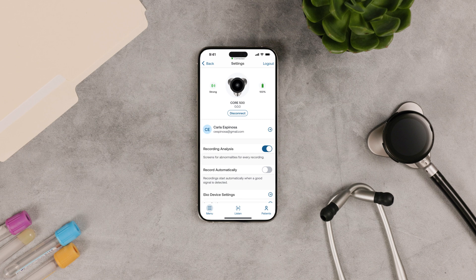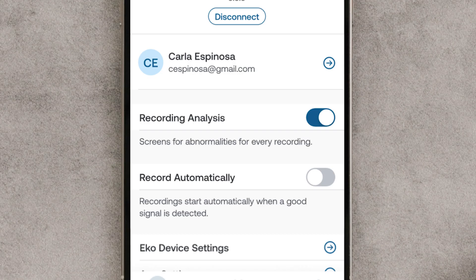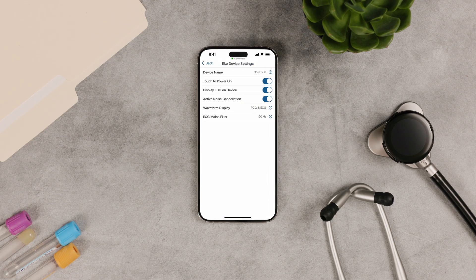On the menu screen, change your app, account, and device settings. Recording analysis uses AI to check for signs of heart disease for every recording — this is on by default. Record automatically means the recording starts automatically when the Core 500 detects a good signal. In the Core 500 settings, you can change the settings for your device. You can turn on or off the touch sensor and active noise cancellation. You can also choose if the ECG waveform displays on the device. See the ECHO Help Center for more details.